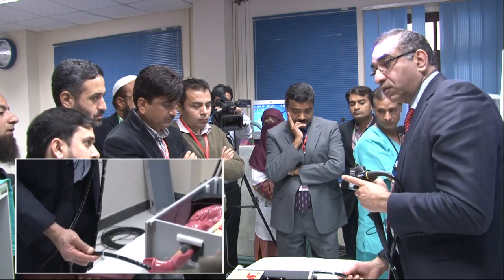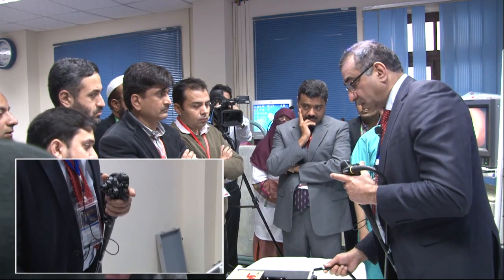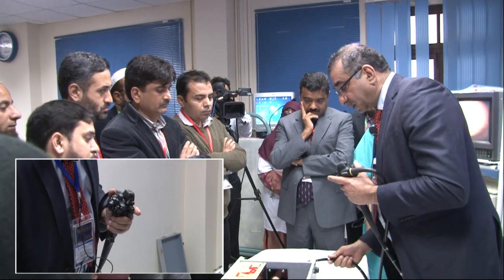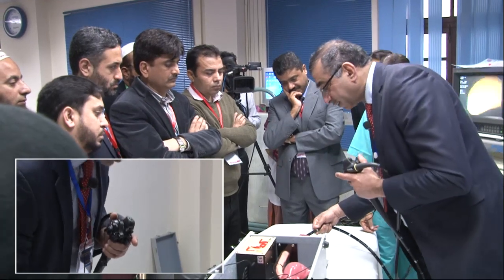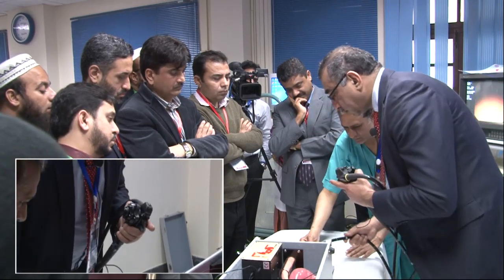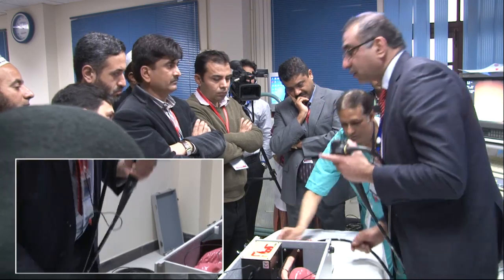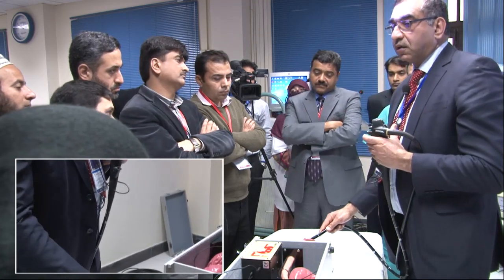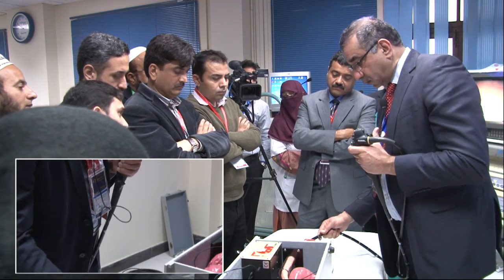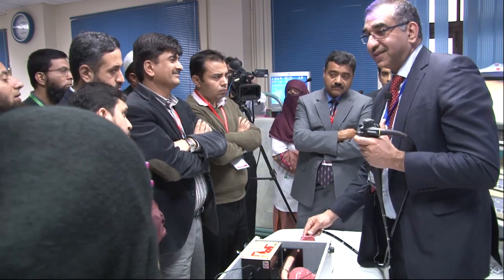Okay. So you do it. You watch your thing and pass on. Exactly what we don't want. Right, okay? So you go down.